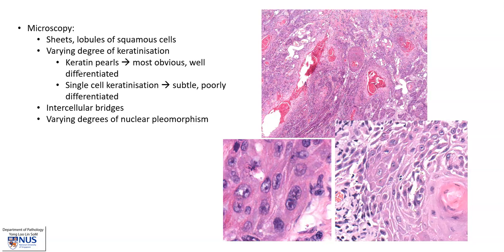Microscopically — and there is a separate video on this — there will be sheets and lobules of malignant squamous cells showing varying degrees of keratinization. We can see some keratin pearls here, and also sometimes single-cell keratinization. The presence of intercellular bridges are features of squamous differentiation, and we may also see varying degrees of nuclear pleomorphism.